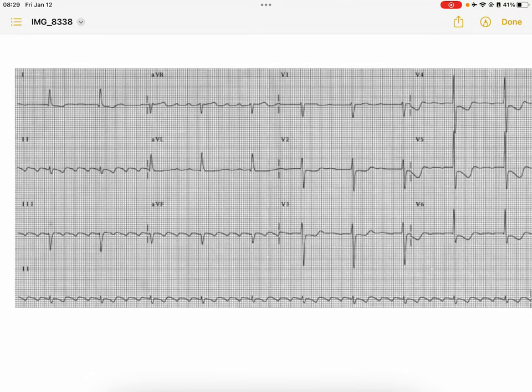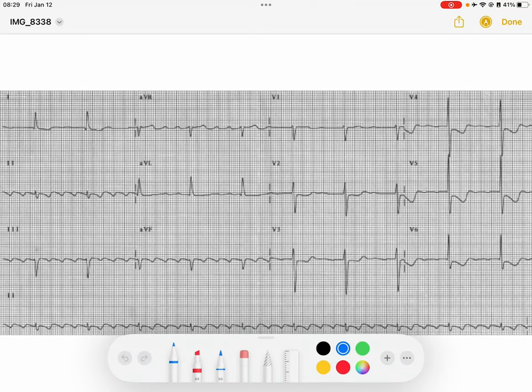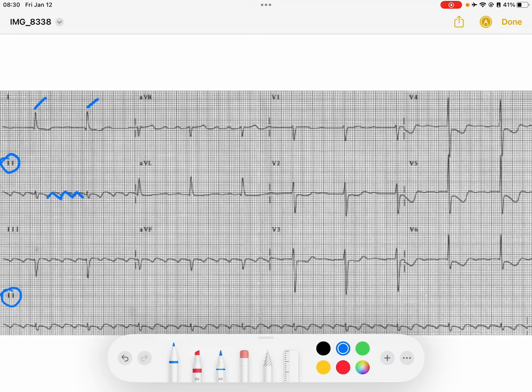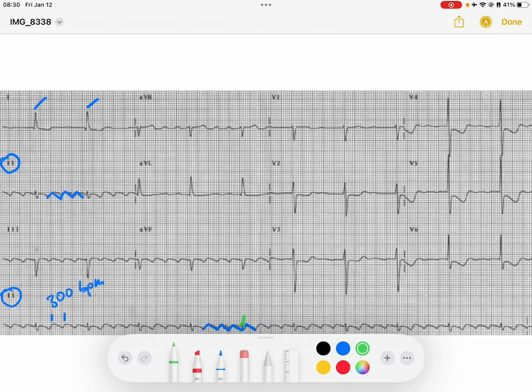Let's take a look at a four-to-one atrial flutter. It's a little blurry, but you'll get the gist. Up here in lead two we've got this sawtooth atrial pattern and narrow complex QRS complexes. The flutter rate looks like around 300 beats per minute. I've got one flutter, two flutters, three flutters, and then a fourth flutter, and then our QRS within those four flutter complexes — then one, two, three, four with my QRS. So this is a good example of four-to-one atrial flutter.